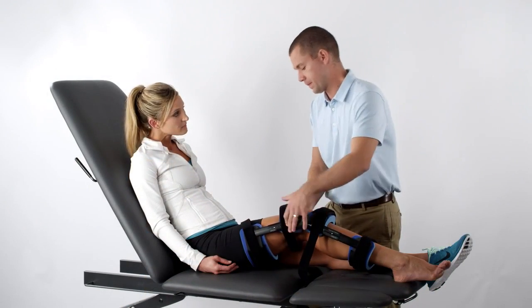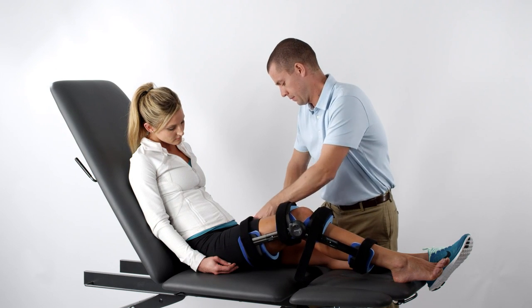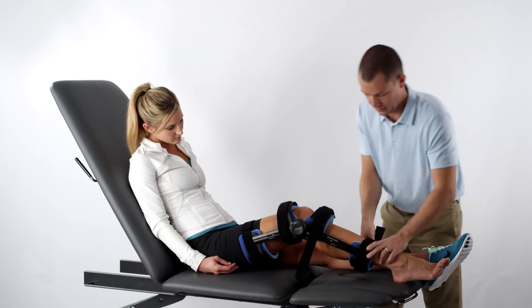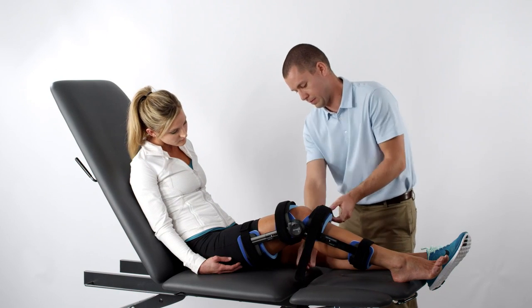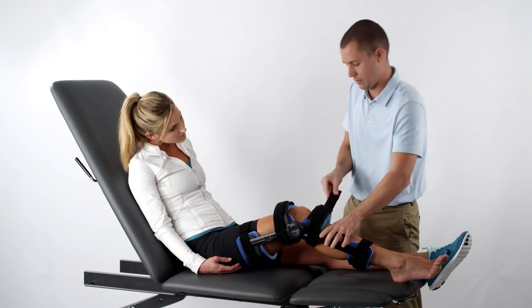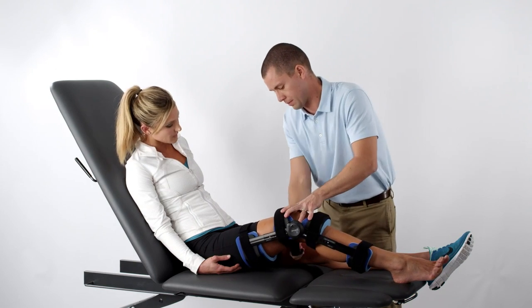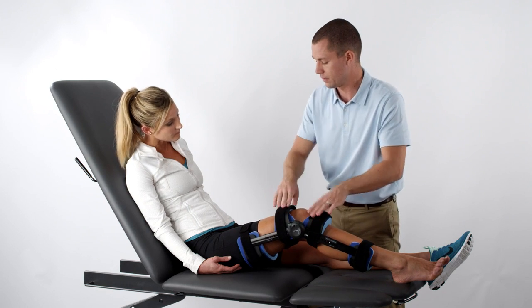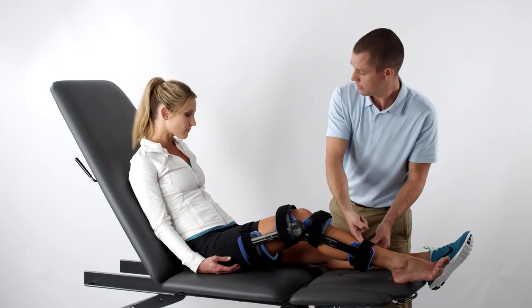Once you've properly adjusted and positioned the orthosis on the patient's leg, secure the straps. If you removed the straps during the initial fitting, reattach them by locating the buckle on the leading edge of the cuff so that the straps are pulled across the open ends of the cuffs. First, secure the proximal and distal straps. Then secure the middle straps. The straps should be snug enough to allow one finger to be inserted beneath the strap and the skin.